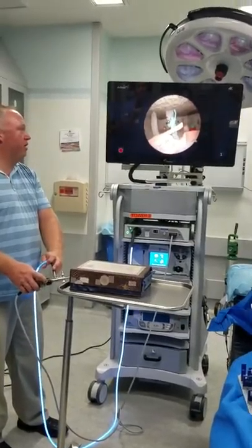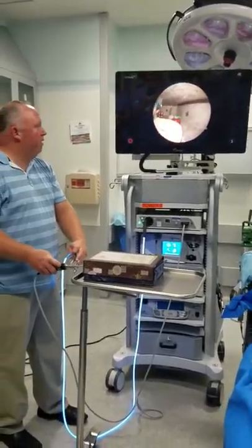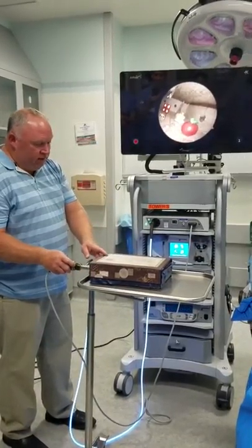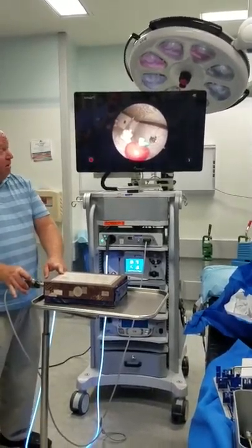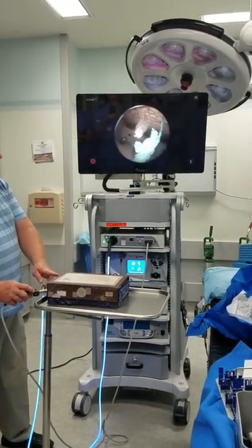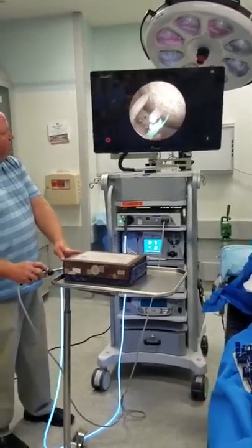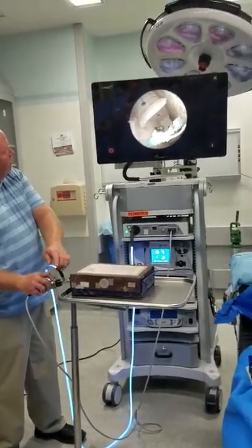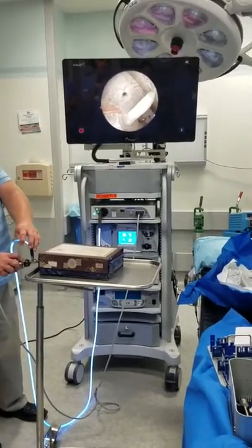Well, you just take the Statue of Liberty, right? Well, you can kind of drive over. Sometimes when you have really big people, you might get to the hub of the scope and you can't go any further. You might make another hole. This is a lot bigger than the case is going to be. There's something above us as well, or next to the side of us. So it's right here. I knocked it down already.